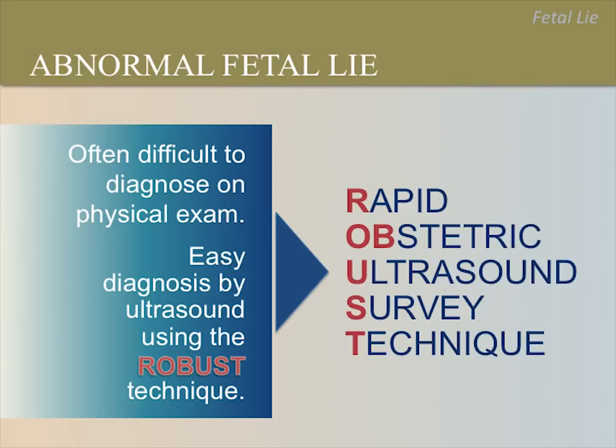Many cases of an abnormal fetal lie or presentation are not found before delivery because it can be difficult to diagnose during a regular clinical exam. As a result, many mothers with an abnormal fetal lie or presentation deliver at a facility that cannot perform a cesarean section if needed.